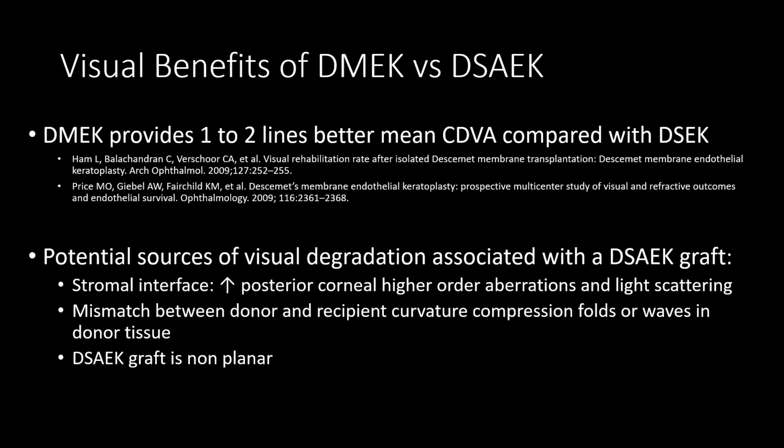Generally, a patient with a DMEK can see 1 to 2 lines better than a patient with a DSEK procedure.